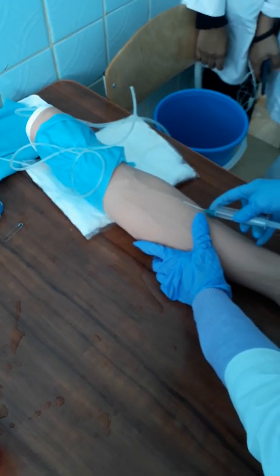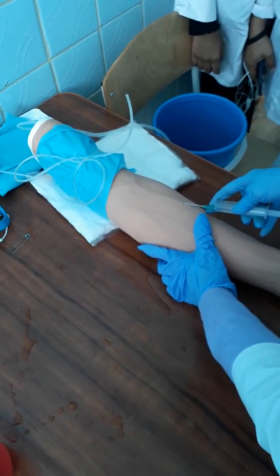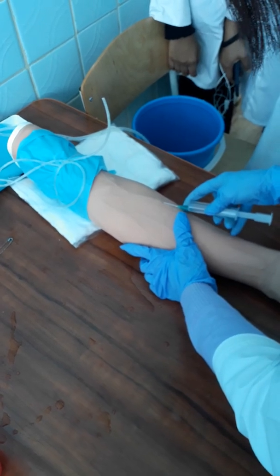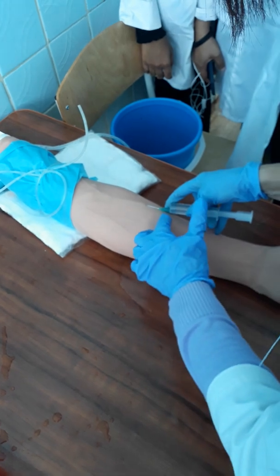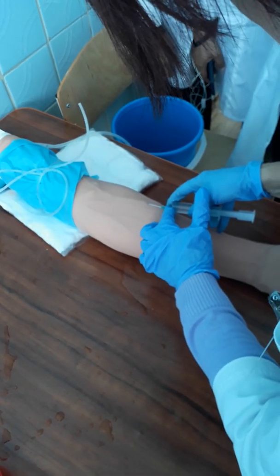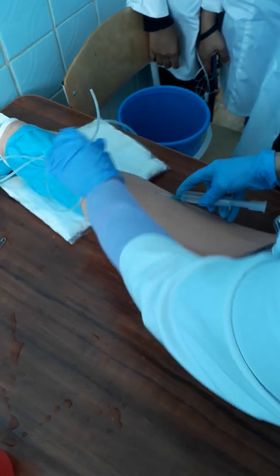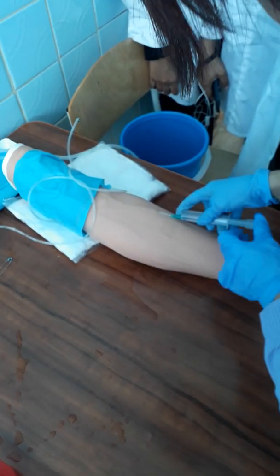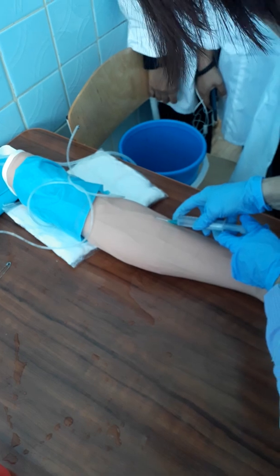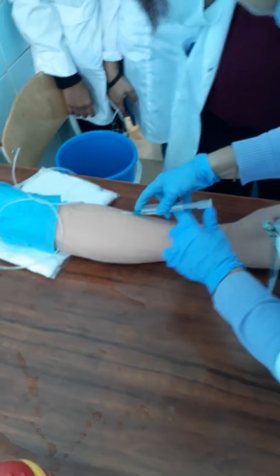you perforate the skin, feel the wall of the venous, press, and continue parallel. If you do it neatly, you will see a drop of blood inside this tip. If you see it, you can remove. Without removing, you only release the tourniquet. Pull the plunger toward you. You again check whether you are in the venous or not.